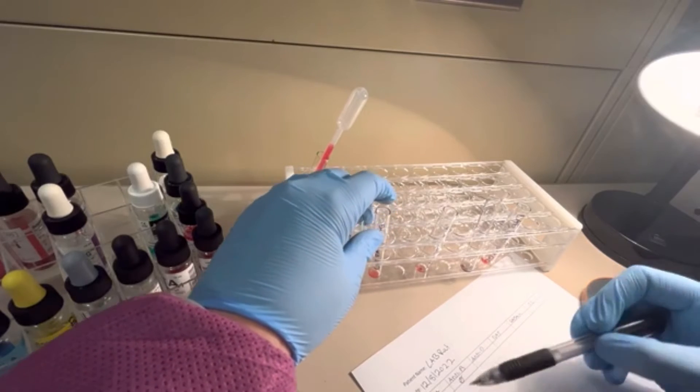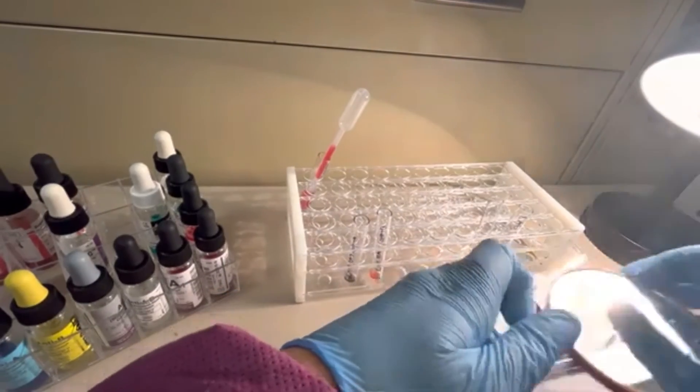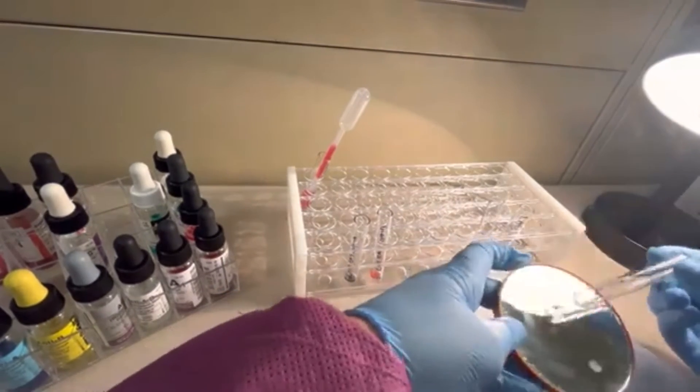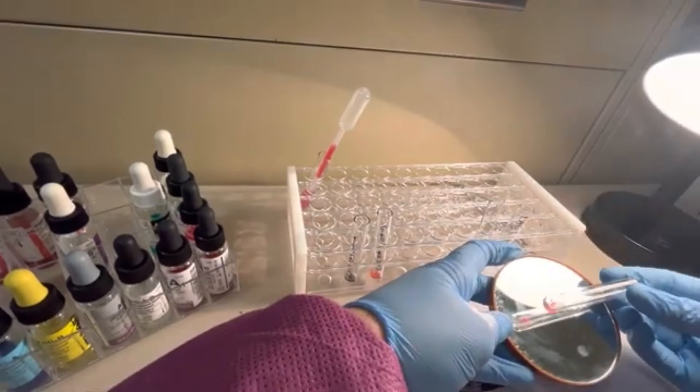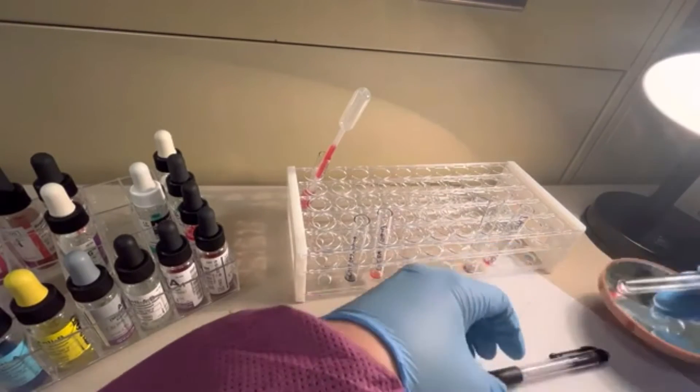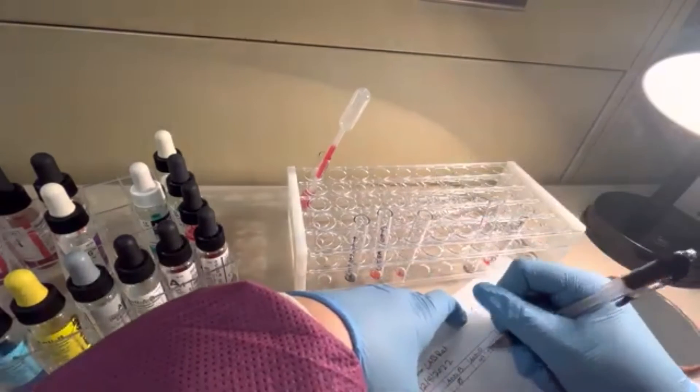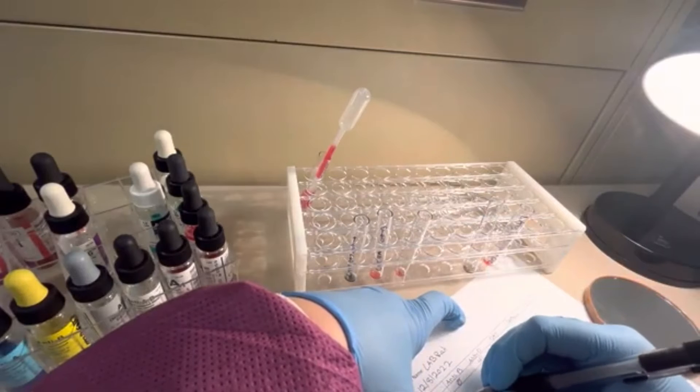Now let's figure out their RH status. We can do that by looking at our anti-D. Oh yeah, that's a beautiful, beautiful clump there. We're going to look. That one is 4 plus as well. So this patient is A positive.